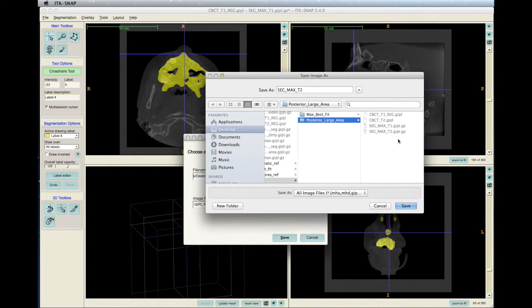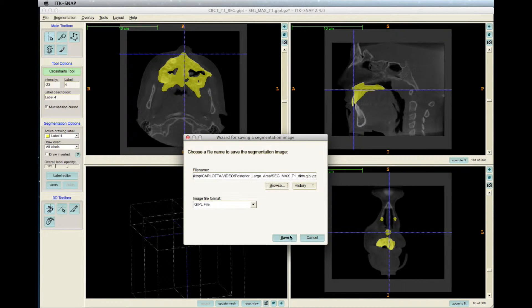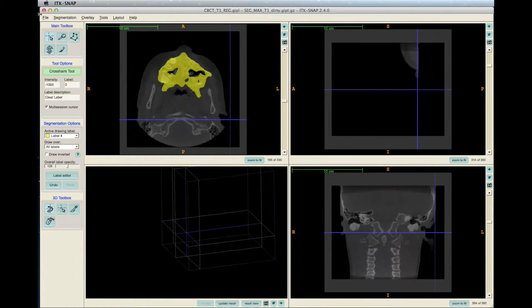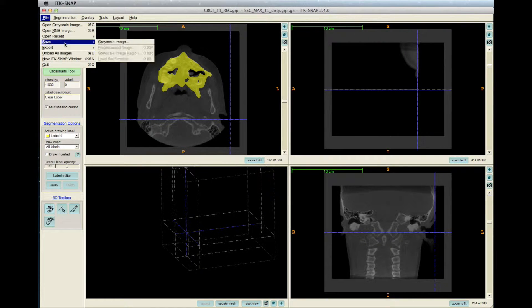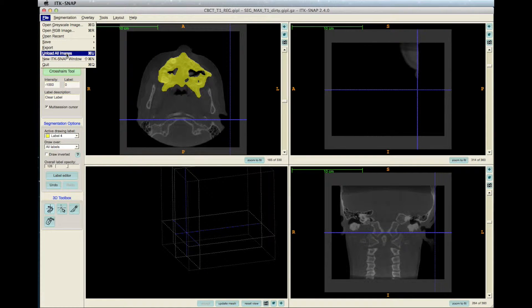Choose a directory and type .gipl.gz at the end. After it's saved, click File and Unload All Images to clear so you can open the new files.